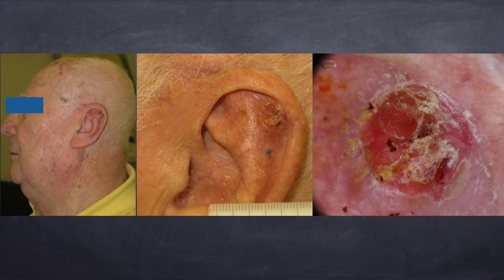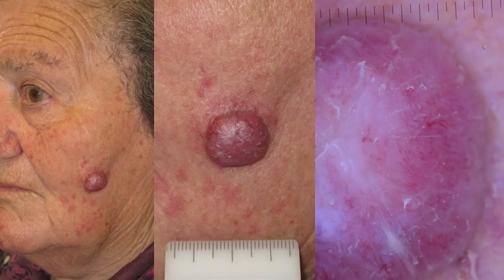Here is another example with white and yellow keratin masses apart from red structureless areas, and here a more nodular tumor in which the differential diagnosis also included Merkel cell carcinoma.